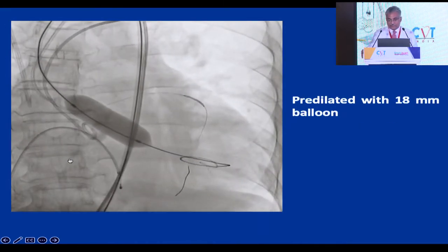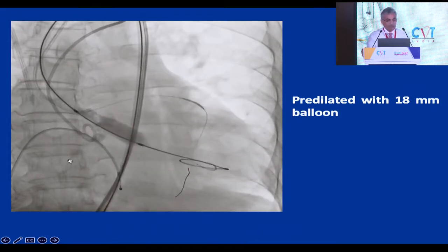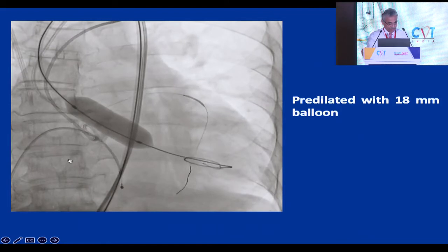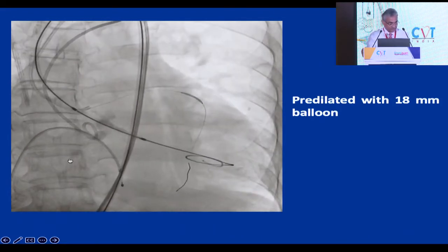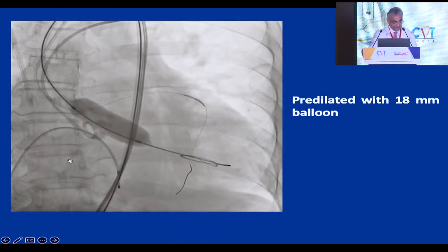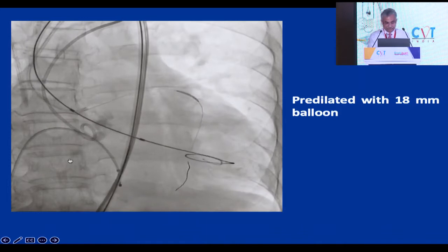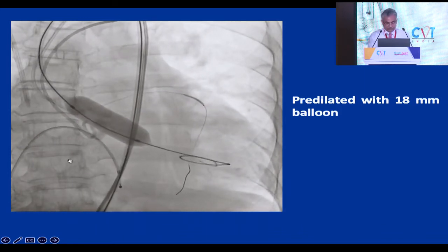So preparation was done with an 18 mm balloon, and we planned to inject at that time, but the injector did not work. We were not in our own lab, so we can't say much about it. They said the injection is not working. So we couldn't realize whether the coronary would occlude when the valve opens. But we had no option but to go ahead. We had already dilated.